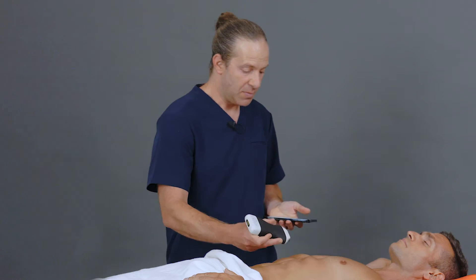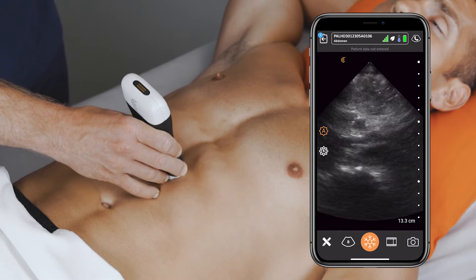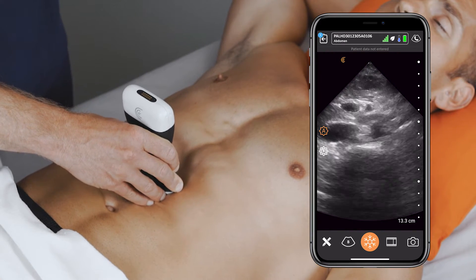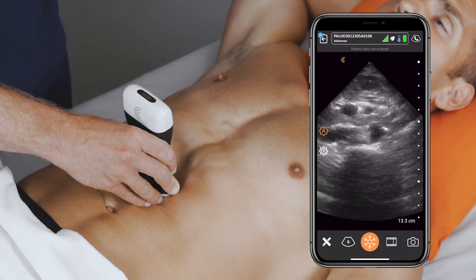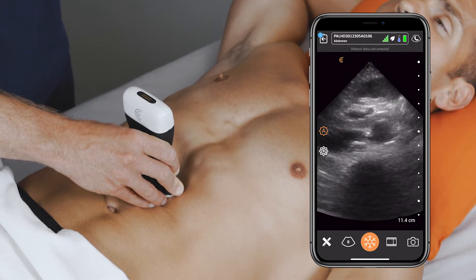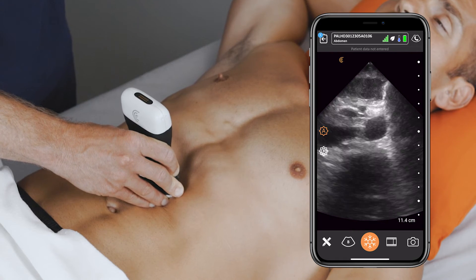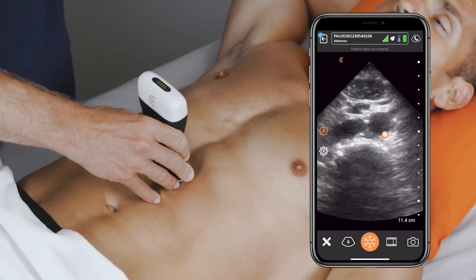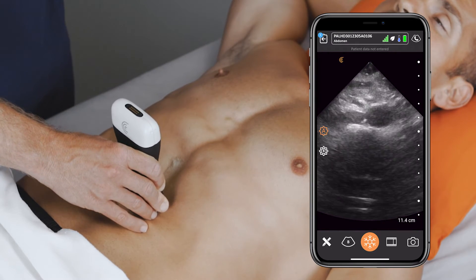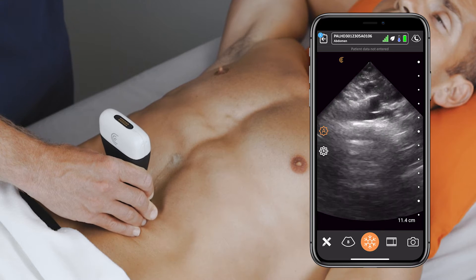The first one on everyone's mind is an abdominal aortic aneurysm. To scan for that, I'm using the abdominal preset here and pushing through the bowel gas to find the vertebral shadow. Once I identify the pulsatile abdominal aorta, I'll follow it down to its iliac bifurcation, usually near the umbilicus.